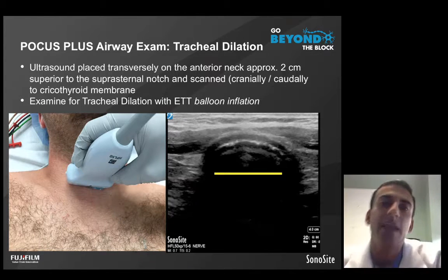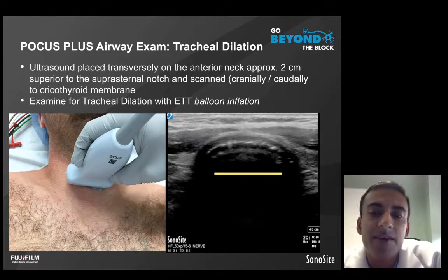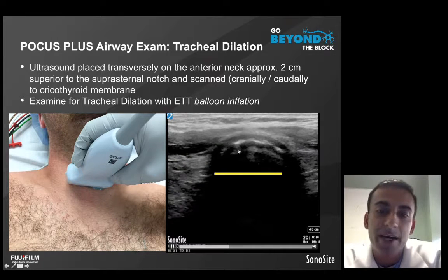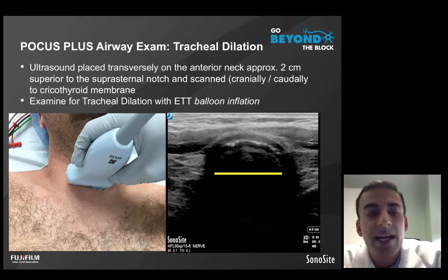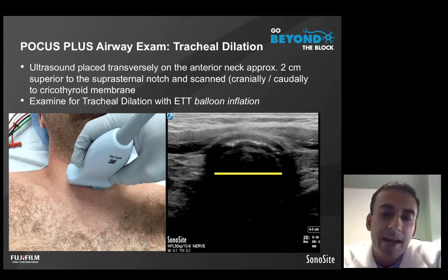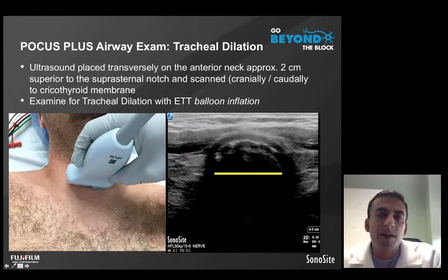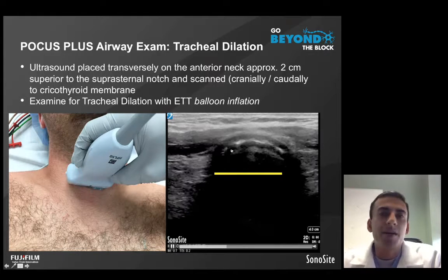It was the absence of tracheal dilation that would trigger us to be concerned about potentially having the endotracheal tube close to a bronchial intubation, meaning within 2 centimeters of the carina. Specifically, if we are not able to scan from the suprasternal notch up to the cricothyroid membrane and identify this phenomenon of tracheal dilation, that would trigger the next component of the examination, evaluating for pleural sliding. So both components were performed for the study. However, the logical methodology we had was first examining for tracheal dilation and then evaluating for the phenomenon of pleural sliding.